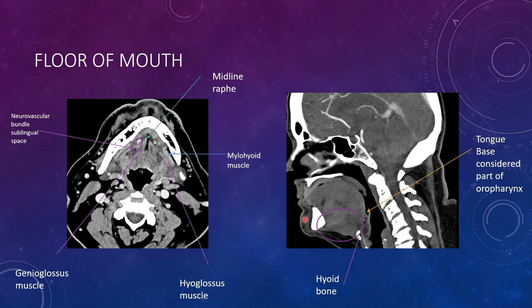Here it is on the sagittal view — just think from bone to bone. Here's the anterior mandible, here's the hyoid bone, here's the floor of mouth. It has a mucosal surface underneath the tongue and also the floor of mouth musculature. The tongue base, which is posterior to the hyoid, is actually considered part of the oropharynx.